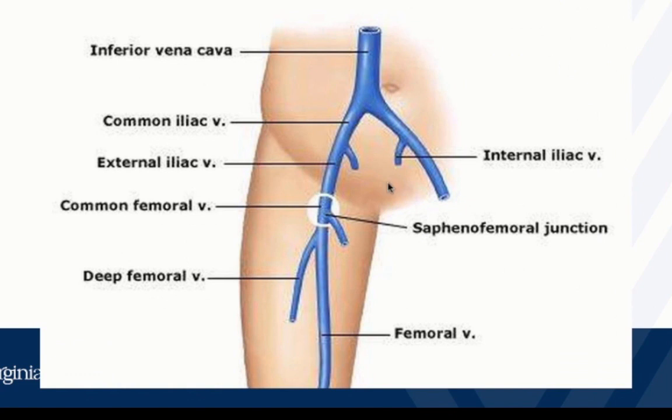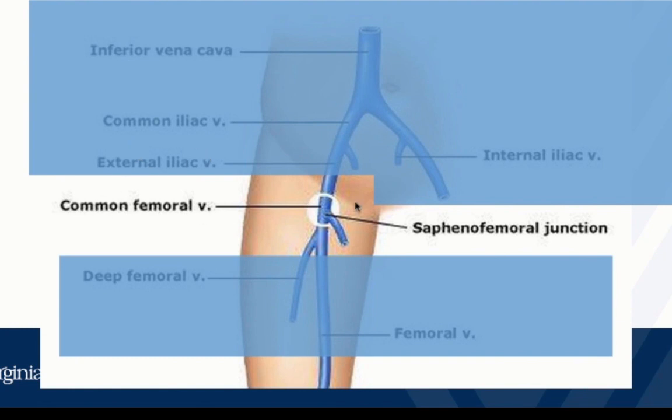Here are the inguinal veins we're going to look at. We mostly start our exam right at the inguinal crease, although most of the time when we place the probe it will be somewhere below the sapheno-femoral junction. Most of the time we're going to find the femoral artery and the vein next to it, and the sapheno-femoral junction is often proximal to where we first place the probe. Search up and down until you find that junction — that's our most proximal starting point. We want to find the common femoral vein and slide the probe either towards the head or towards the feet until we find the sapheno-femoral junction.